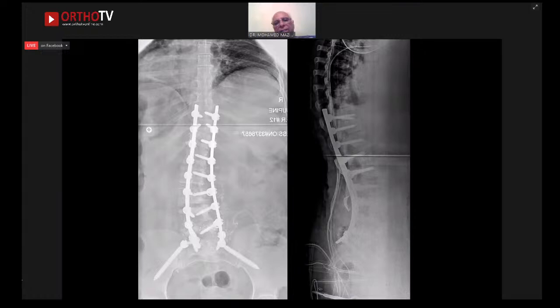extended fixation, and of course they put bone graft. You can see the graft. Here we can put very long fixation, but sometimes they underestimate the value of the graft in some practices, and this also makes me afraid. If you do a very long extended fusion and don't put sufficient graft, and you have osteoporosis, the union rate is not high.